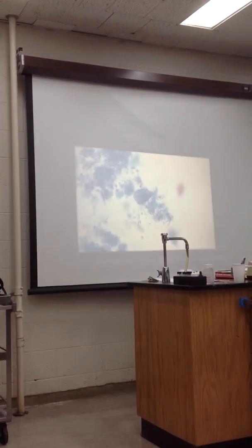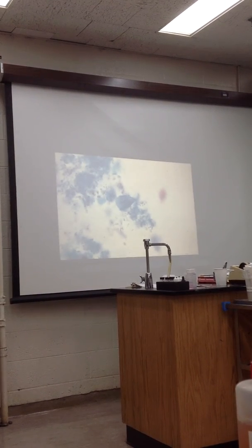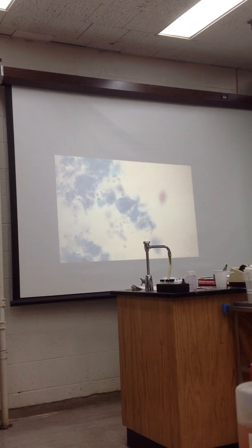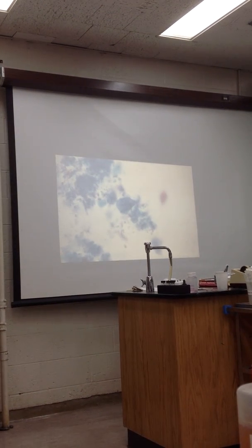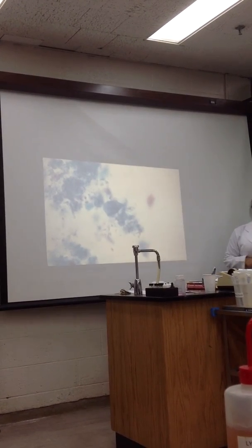In other words, where I give the patient the gelatin capsule to swallow. And then I scrape this stuff off and put it on the slide and look at it. And I'll find this organism with the two big eyes looking back at me. The Entero-Test. Giardia lamblia. Yeah, right there on the board too. It's in the lab book also. We just went over it.